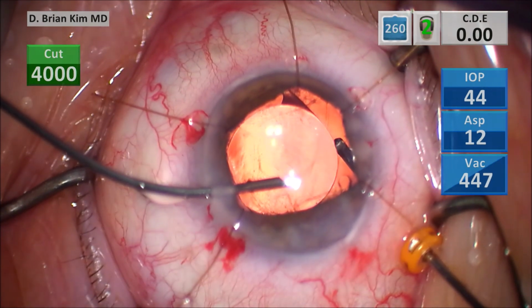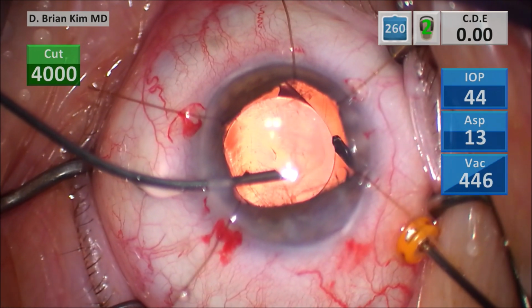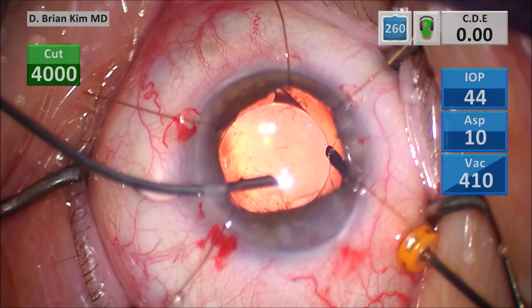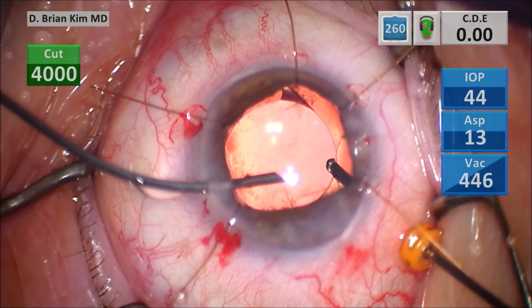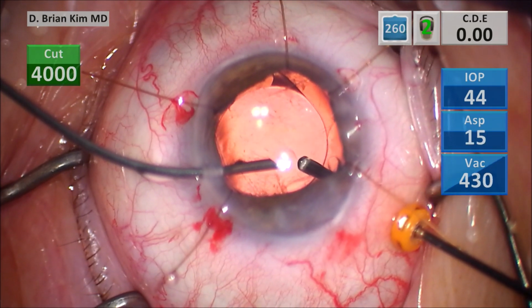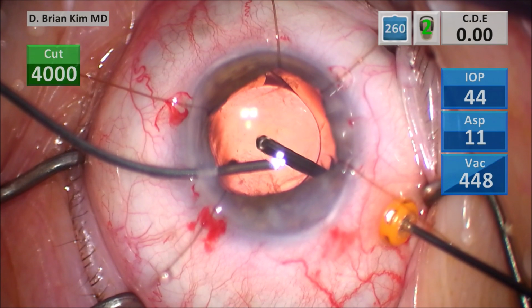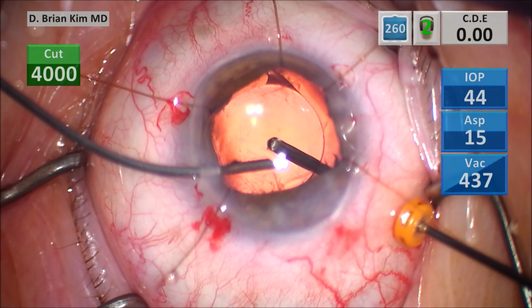But again, because of that infusion pressure, it does cause that volume to cause the vitreous to come forward. Because of that infusion pressure, and there must have been, again, some posterior capsule defect at some point, it caused that split. And then I was able to go in to the pars plana, remove that volume, remove the vitreous.